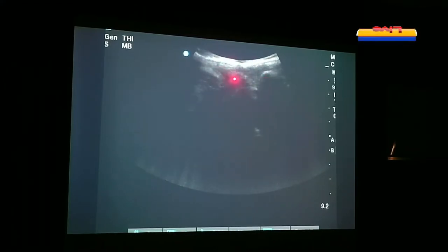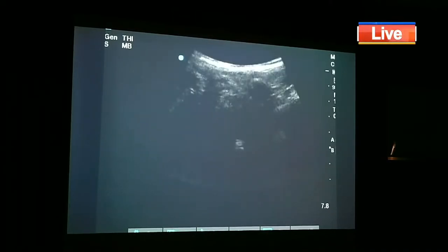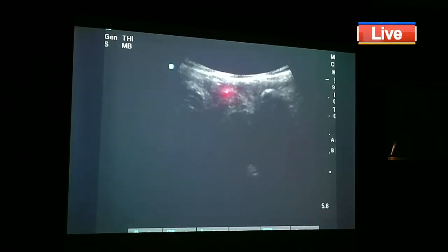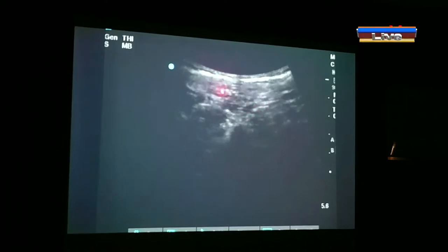Yes, and so then you see S1, keep on going up. L5. No, ma'am, that one is L5. Depth control. This one is L5. Yes, the first one is L5. Then we go up, L4. Then we go up, L3. And like that. Now, I can bring this to the center of my probe like this.